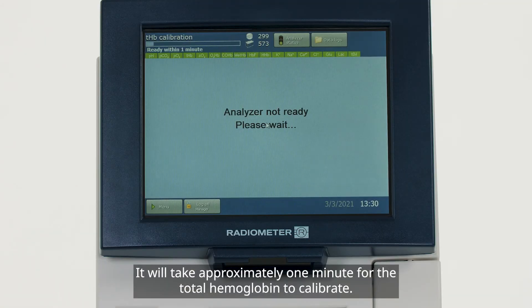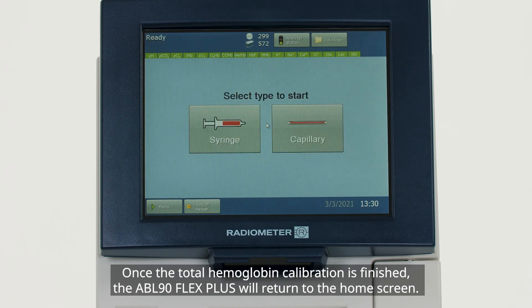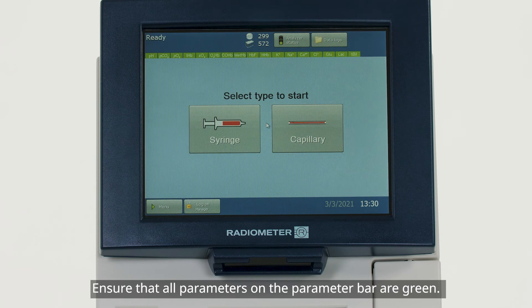It will take approximately one minute for the total hemoglobin to calibrate. Once the total hemoglobin calibration is finished, the ABL90 Flex Plus will return to the home screen. Ensure that all parameters on the parameter bar are green.